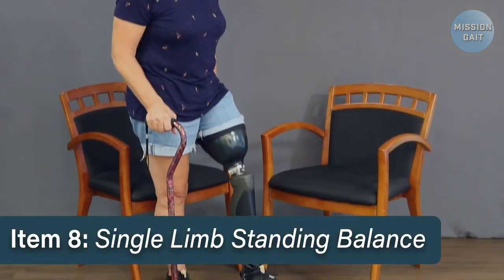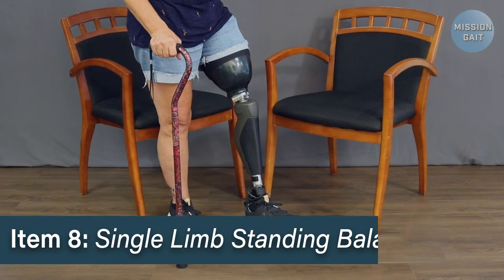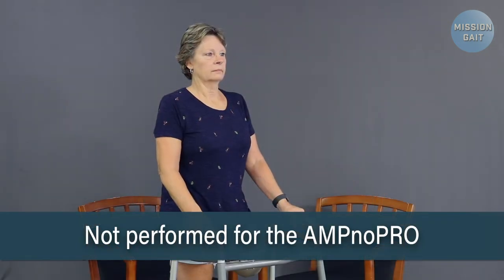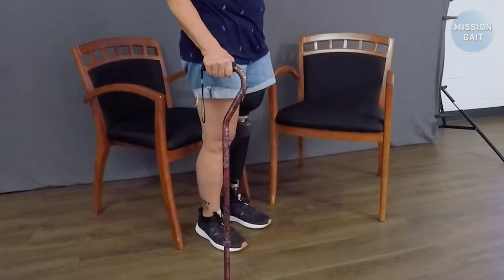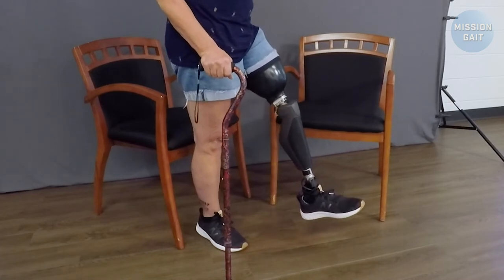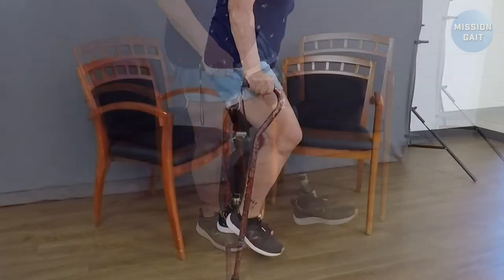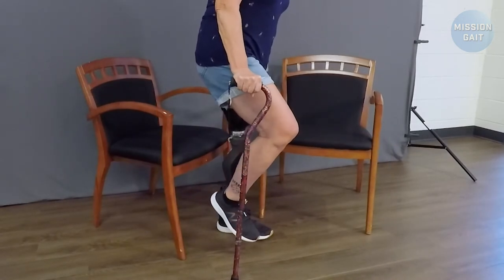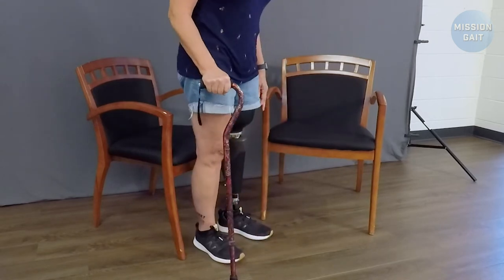Item eight, single limb standing balance. If performing the AMP No Pro, skip this item, assigning no score. For the AMP Pro, have the patient attempt to stand on one limb at a time, performing the task on both sides. Time the patient using your stopwatch up to 30 seconds, allowing the patient to use assistance as necessary. Allow only one trial on each side.